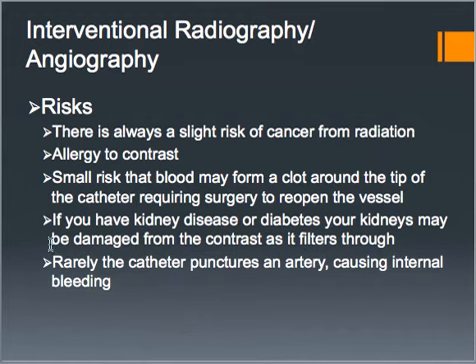There is a small risk that blood may form a clot around where the tip of the catheter is. If you have kidney disease or diabetes, your kidneys may be damaged from the contrast. And very rarely, the catheter can puncture an artery, causing internal bleeding, which obviously is never good, but it's very rare. There is also the risk that the patient could still need surgery after this interventional radiology procedure. It's usually about a 0.1% risk of still having to have surgery.